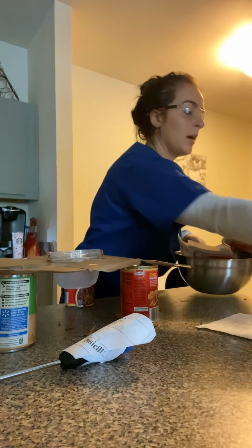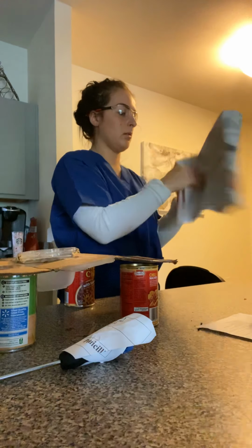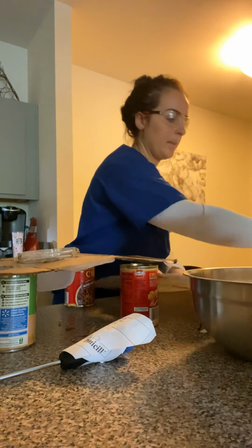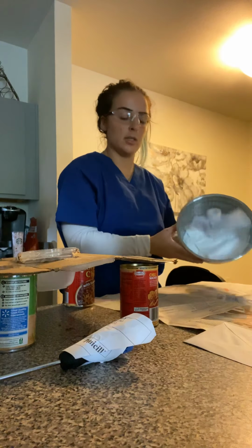I'm opening it up, and I'm going to place my sterile field. And then I'm going to dump the contents of the basin out on it. There we go.